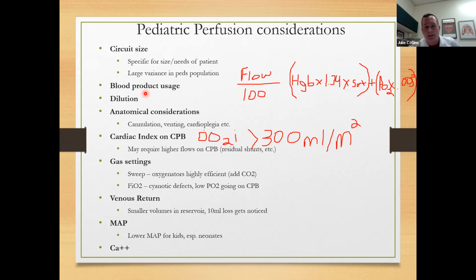And hypocalcemia is actually something that we're okay with when we're cross-clamped. It's actually kind of optimal. But once we take the cross clamp off and the heart is coming back and beating, it's more advantageous for us to get that calcium up to a high normal level, because that'll allow us to successfully wean from the heart-lung machine.